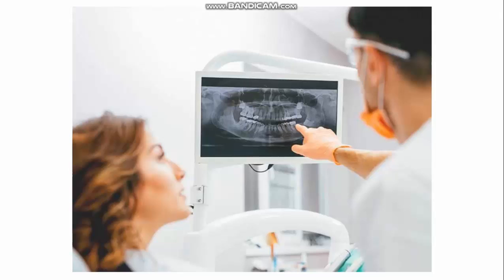Also, with the help of these methods, we can diagnose malignant tumors of the maxillofacial area in early stages. Volumetric computer tomography is the newest method of analyzing and discussing with the patient a treatment plan a priori using dental implants, and it makes it possible to check the results.